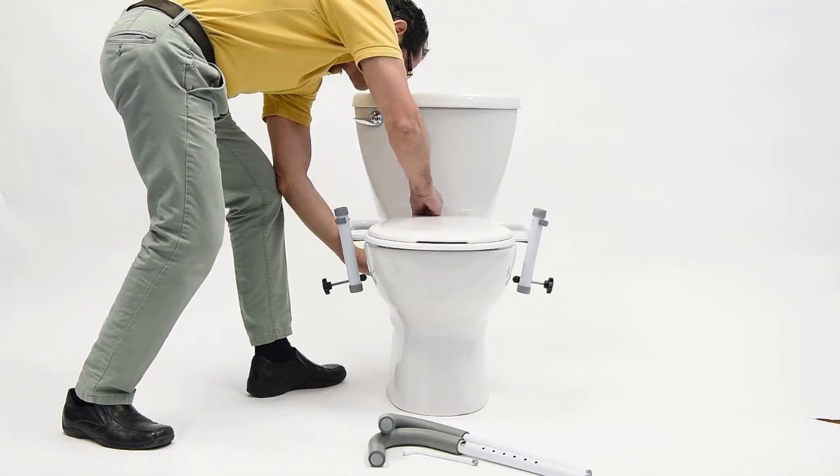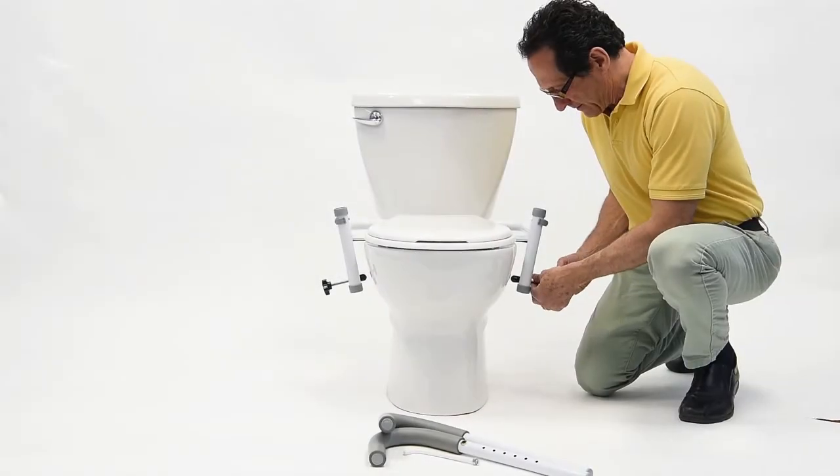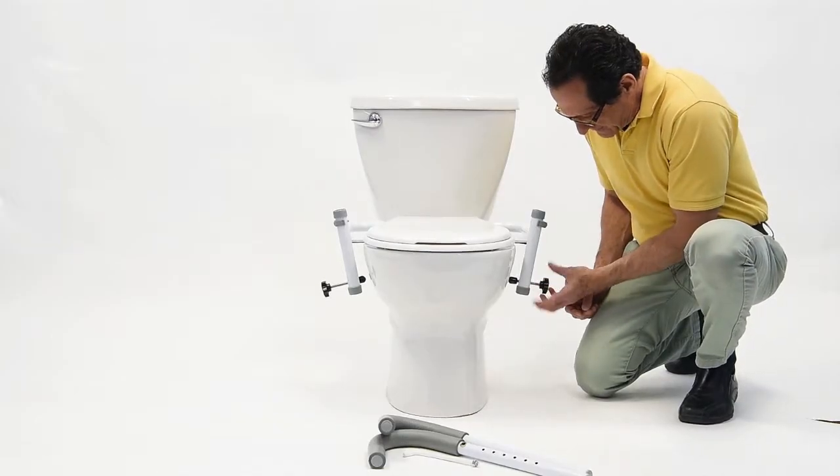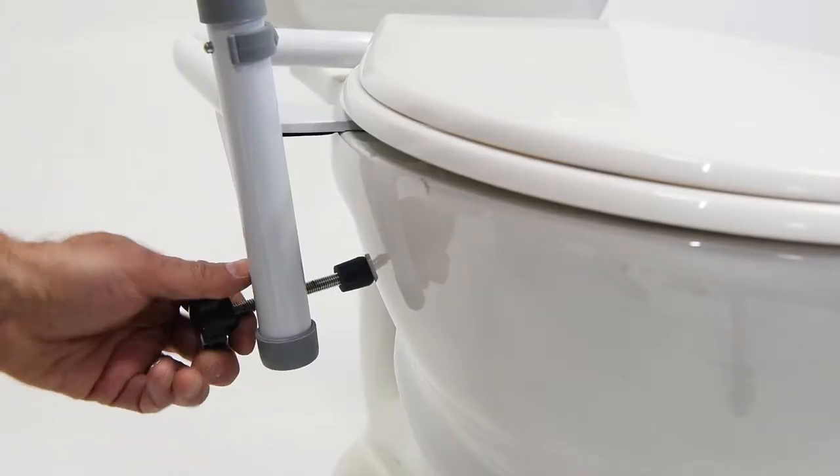When you've installed the toilet seat hardware, it's time to secure the entire unit to the bowl. To do so, turn the tension adjustment knobs clockwise until it is snug on both sides.